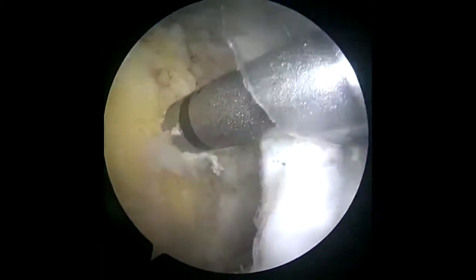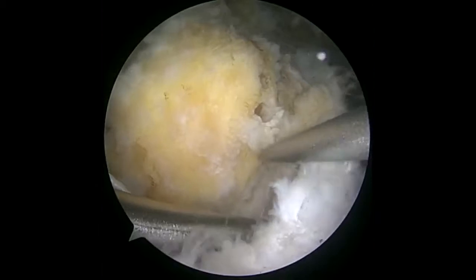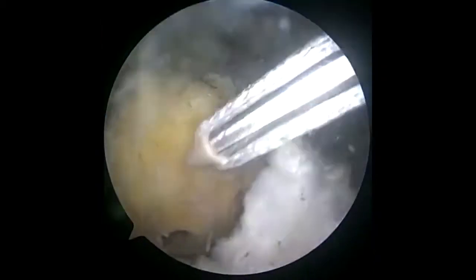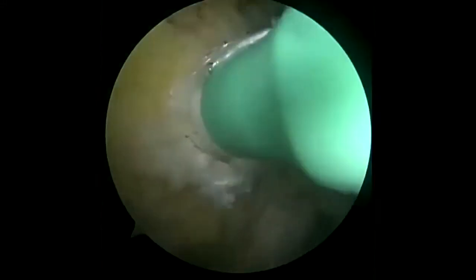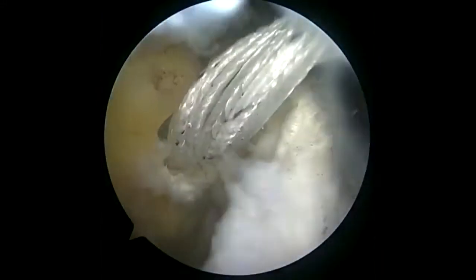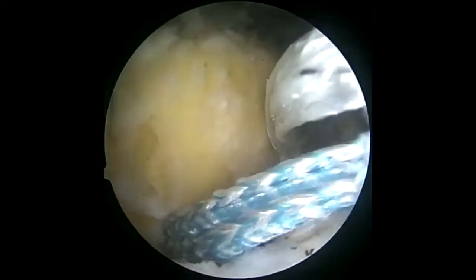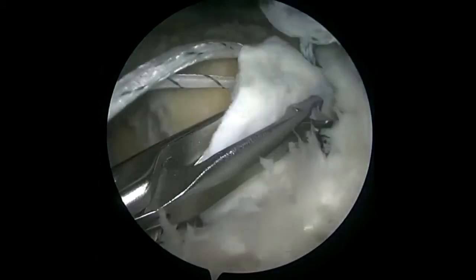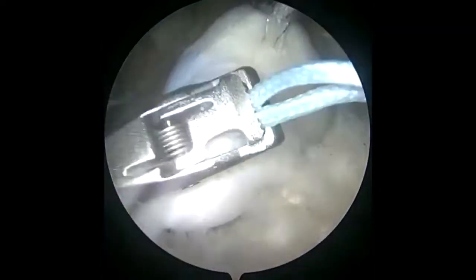Two single-loaded anchors are placed in the humerus approximately 5 to 8 mm from the bicipital groove. The anchors should be placed as far apart as possible, but within the dimensions of the graft. Two sutures are passed through the graft approximately 1 cm from the lateral edge of the patch, one in the superior and one in the inferior corner.